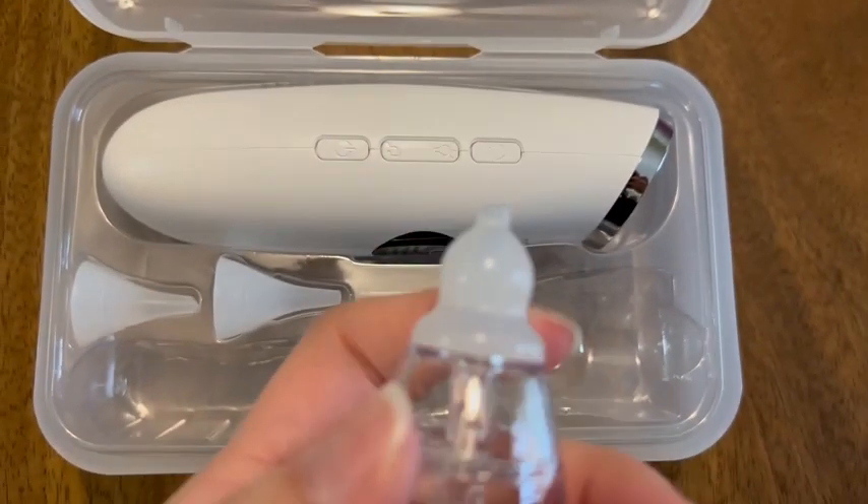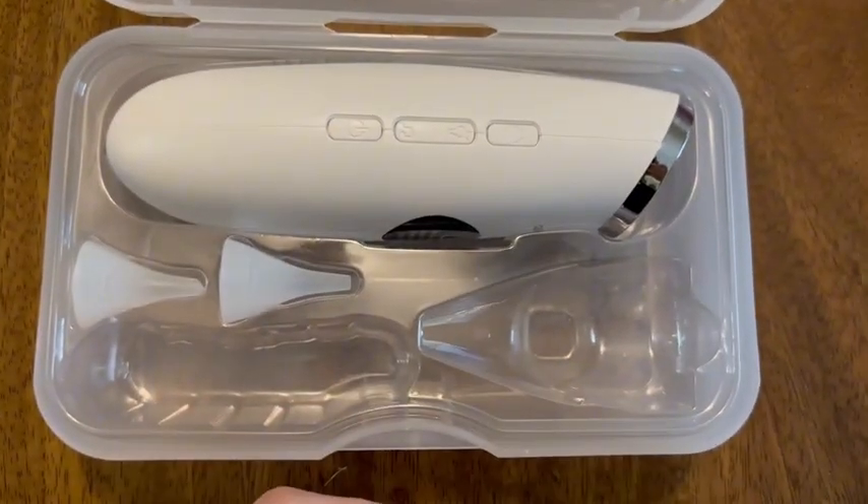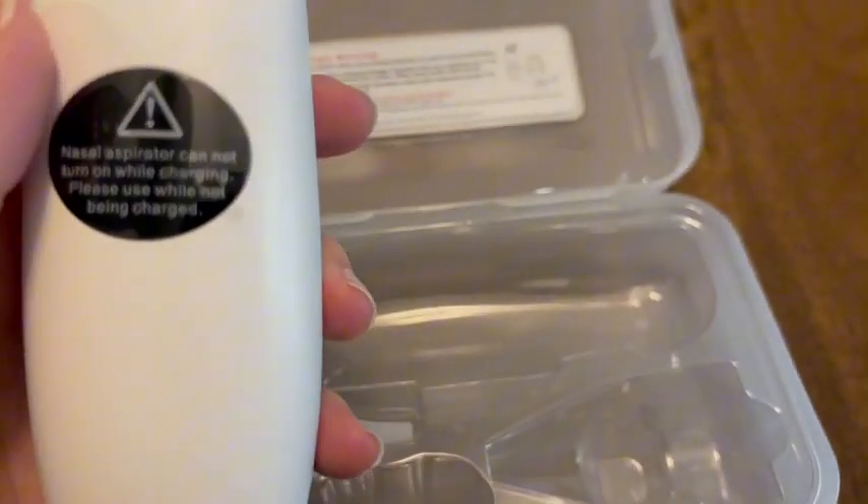This is the piece that all the snot is going to collect in, so everything here is reusable and washable. All you have to do is run it under some warm water and make sure it's cleaned out really well between uses.